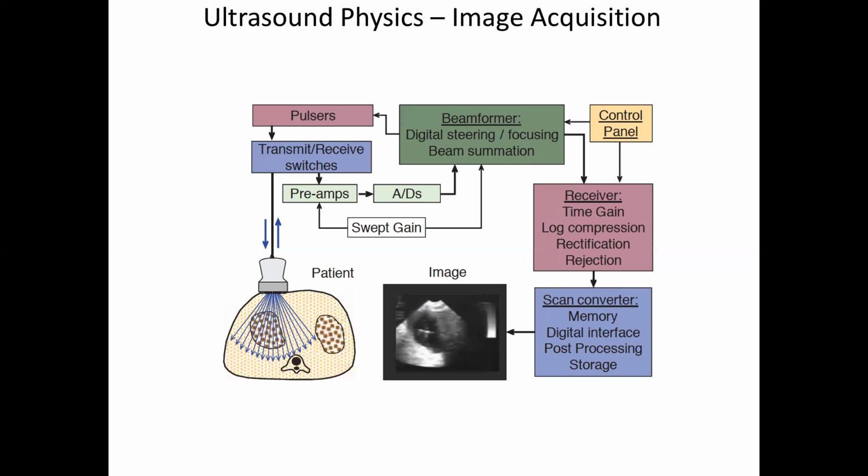And so obviously, as you change that rejection threshold while watching the image, you're going to have an image that's full of noise and all of this crazy stuff. Then as you turn the rejection up, the background noise will go away and your features will come into view. That can be done interactively also. And then you basically put it up on the screen so somebody can look at it and adjust things here.